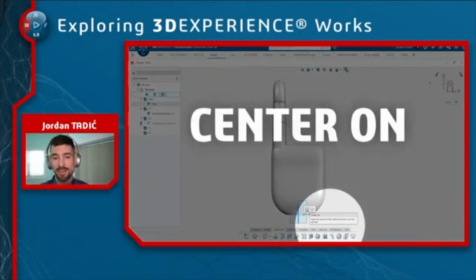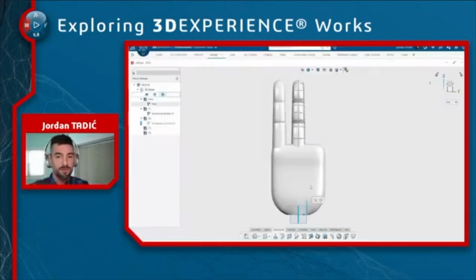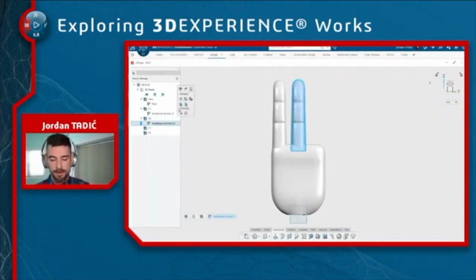And also on the context toolbar now is a center on command. So that bounding box that we showed, it's creating that in the background and dividing it by 2 and moving it so that it's perfectly centered on the plane that you've selected. And you could essentially do this for the front, top, and right plane and have it right on the origin as far as you need it to be.